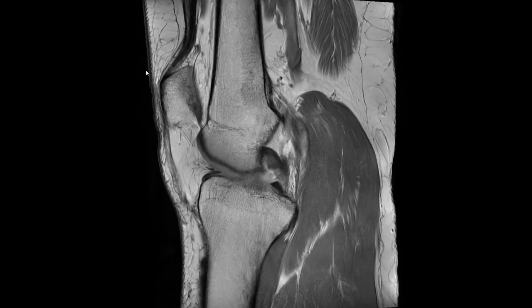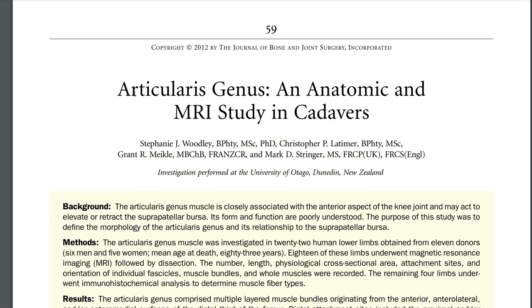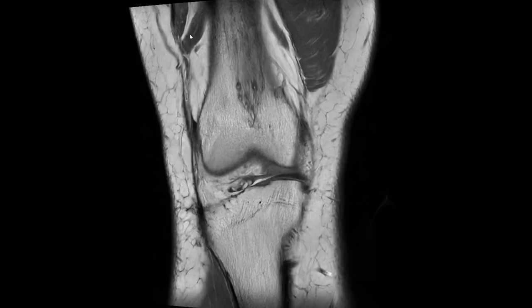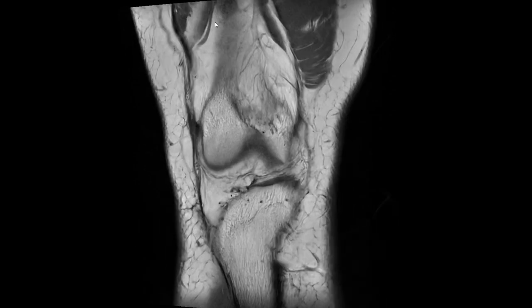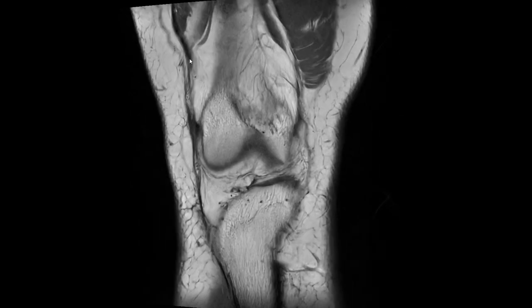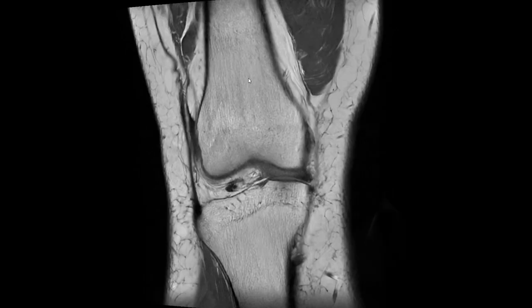This is actually the musculus articularis genus muscle. It has different bundles — that's a nice image where we can see all these different bundles coming down. In anatomic studies there are about seven or so, but that's variable in different sizes. They originate from the distal aspect of the femur shaft on the lateral, anterior, and medial side, and they go distally and insert into the suprapatellar bursa.